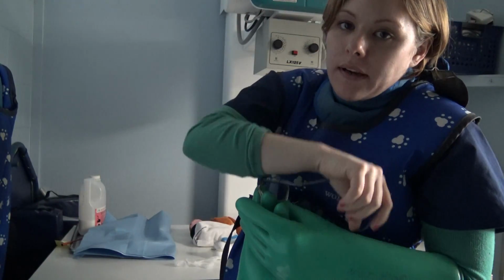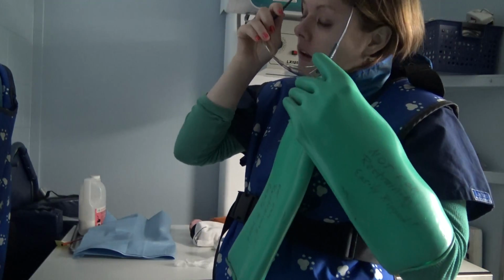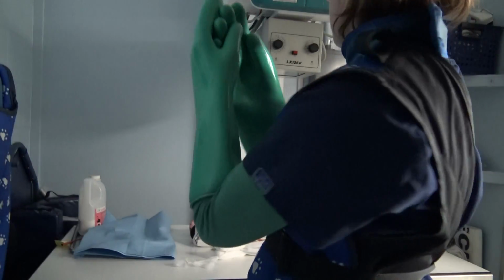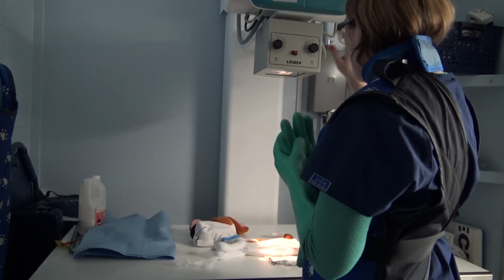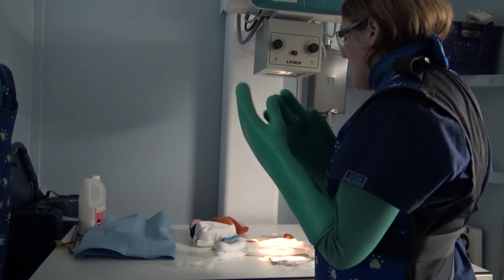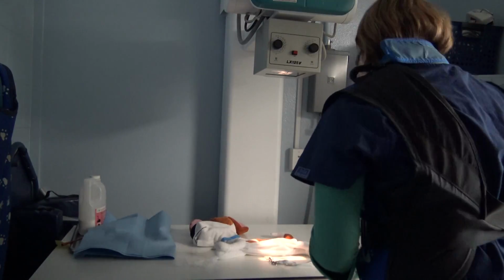And again, since I'm pregnant, I'm still leaving the room even though I'm wearing all the proper equipment, to take the x-ray. I'm double checking that all my settings are correct. And then I will take this right lateral x-ray.